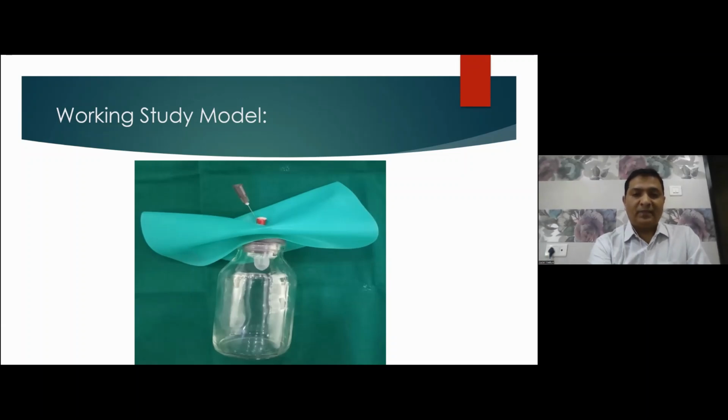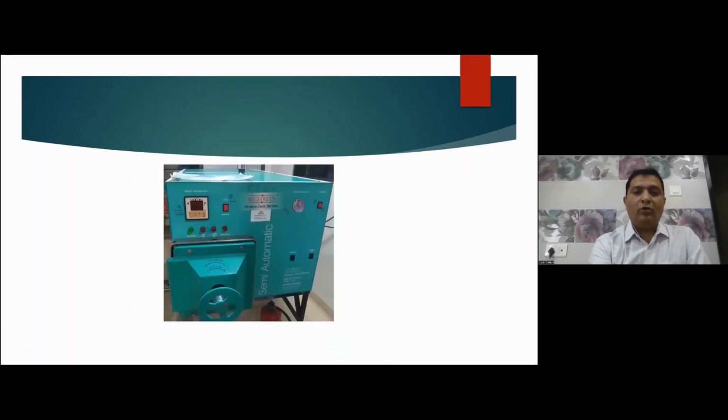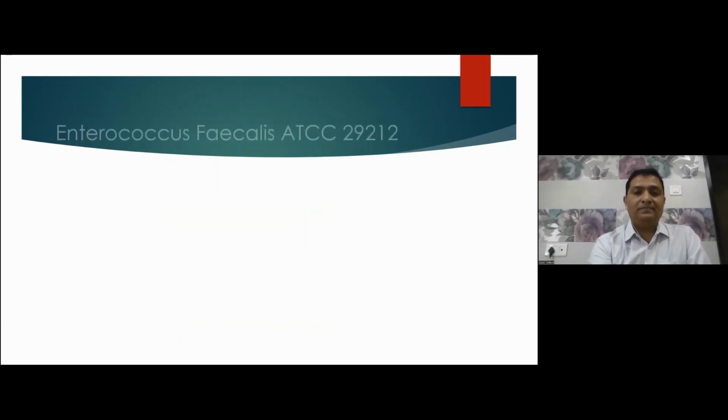A rubber dam was applied on the tooth as per the diameter of the tooth, so as to blind the operator during the procedure to avoid bias. All this apparatus was gas sterilized in an ethylene oxide gas sterilizer for 15 hours.